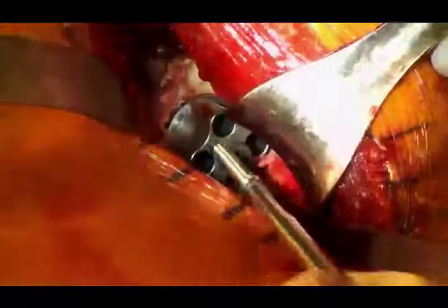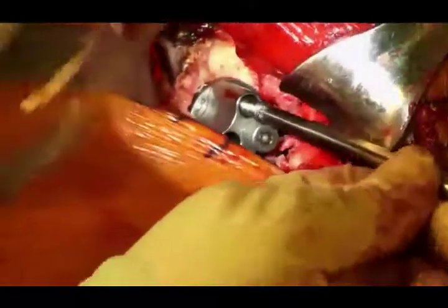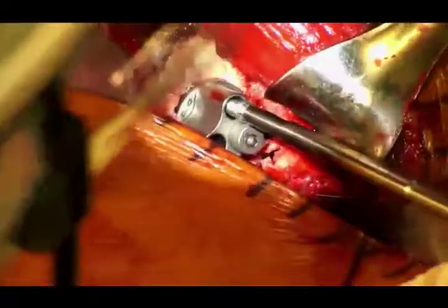One technique variation: I put a 14mm anterior and posterior first, then open those up before starting, with the superior and inferior screws being the longer ones. In this case I happen to get great length on the front and back, so why not use a longer screw if I can get it?